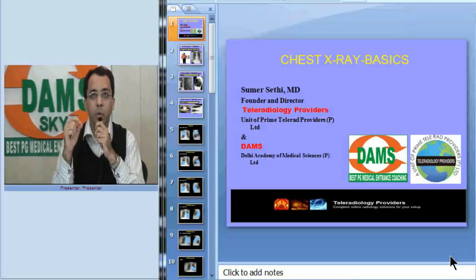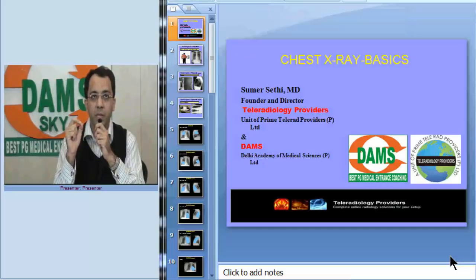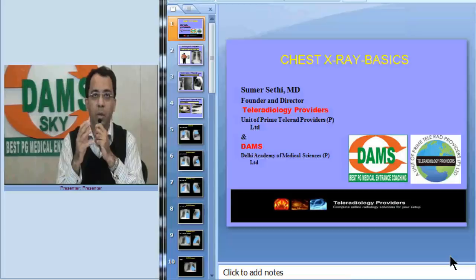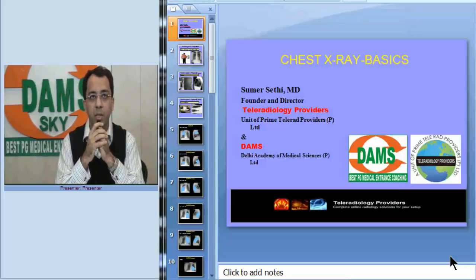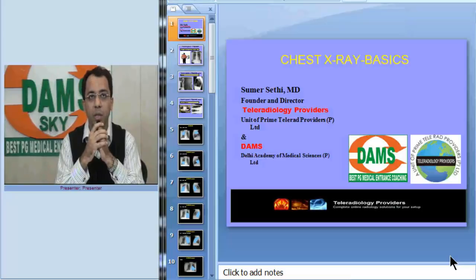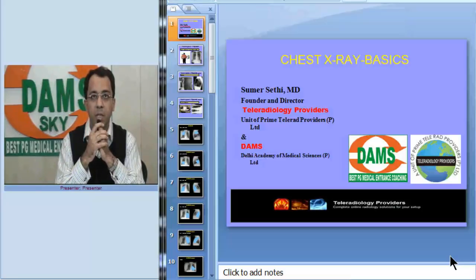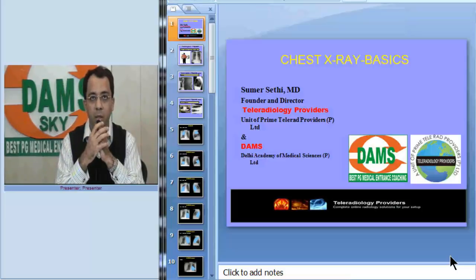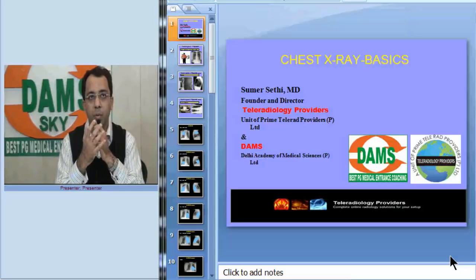Hello everybody. Today we will discuss basics of chest x-ray. The goal for today's lecture would be to see how anatomical structures are seen on a chest x-ray, how to evaluate the cardiac silhouette, and how to evaluate the lung anatomy on a chest x-ray. This is intended for people who want to begin interpreting a chest x-ray and how to form an approach for day-to-day reading.